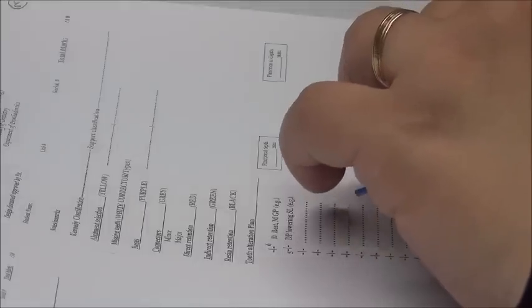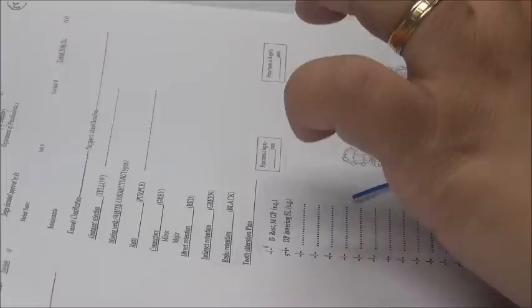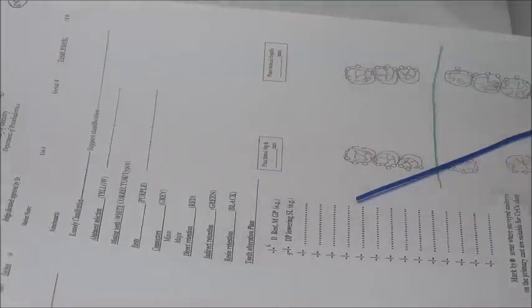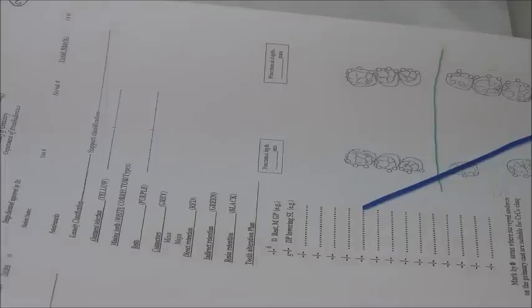This is a tripod design. With a tripod design, meaning I have a rest here, a rest here, and a rest here. So this is my principal fulcrum line, and this is the indirect retainer. But do I need to add for indirect retention? No, I added for another reason, which is cross-arch stabilization. It's not for indirect retention.